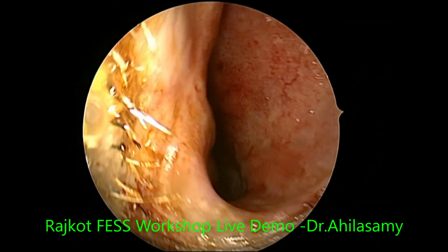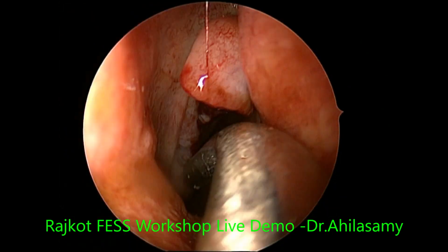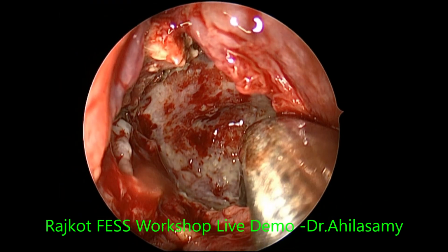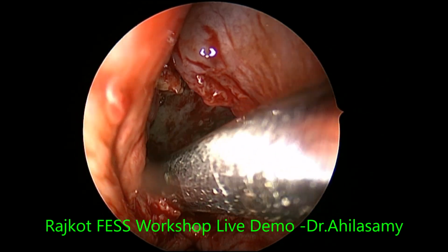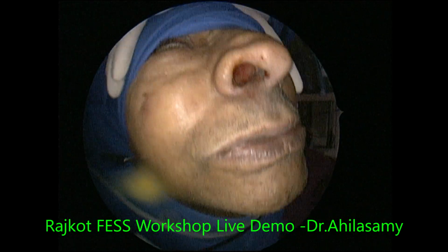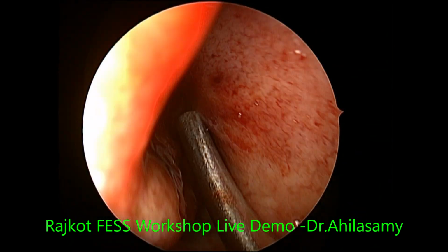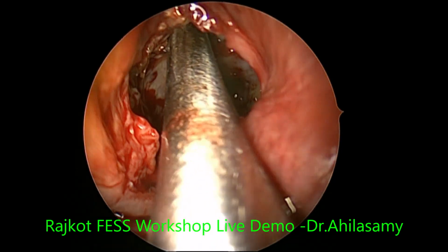I will give Jangri. Jangri is coming. He is sleeping, so I am telling Jangri so that he will wake up. We have stopped the sedation. A little went more, so he is sleeping a little, and we will wake him up. He is in a waking condition only.